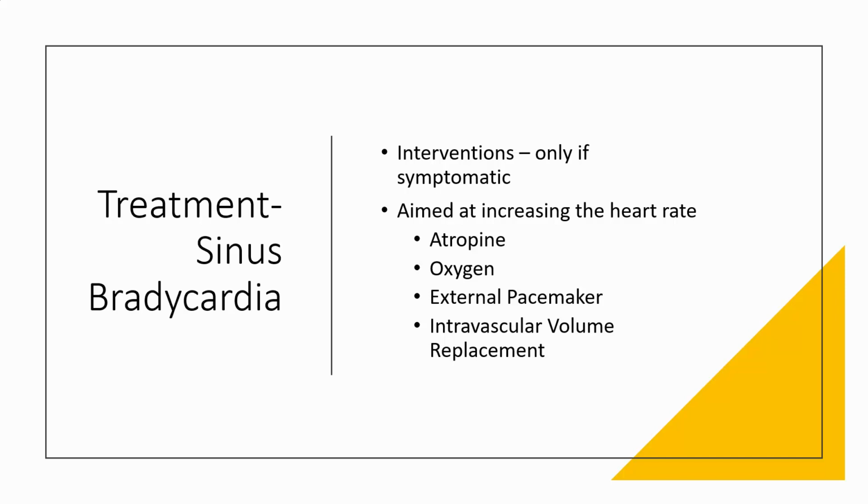external pacemaker. I'm sure a lot of y'all have seen it in clinical practice, but it looks like a defibrillator, and it is a defibrillator to a certain extent. It could be used that way. Your defibrillators have lots of different functions, for lack of a better term. So what we do is we put the cardiac pads, one on the front and one on the back. I call it a heart sandwich.